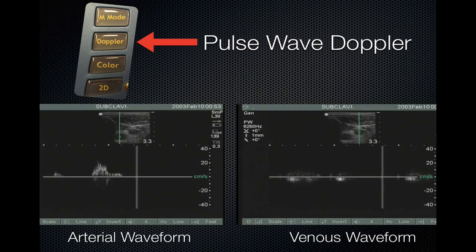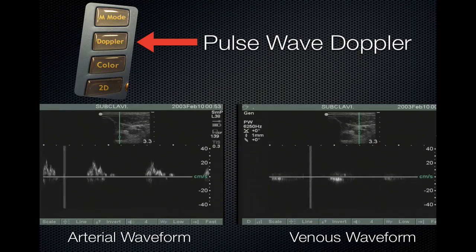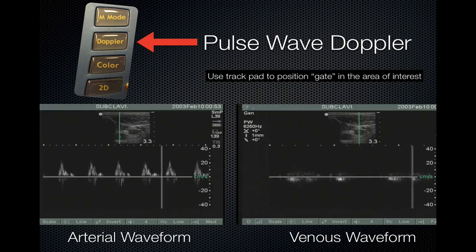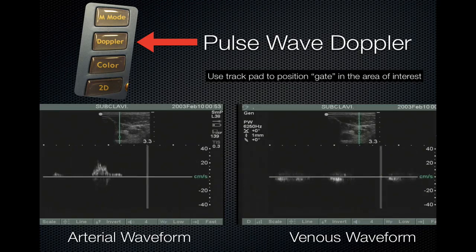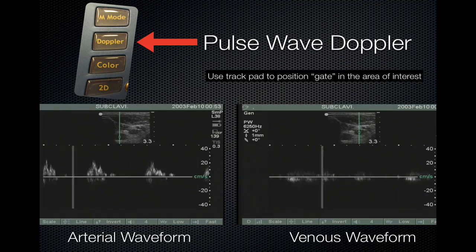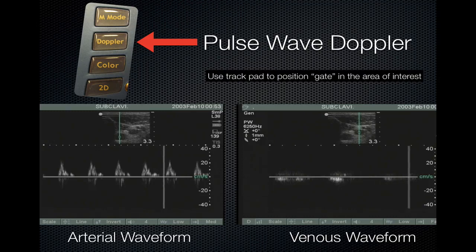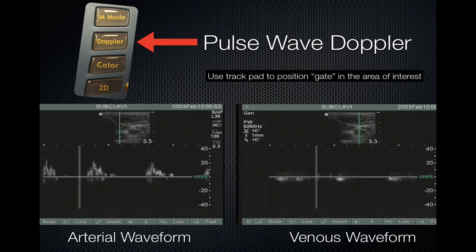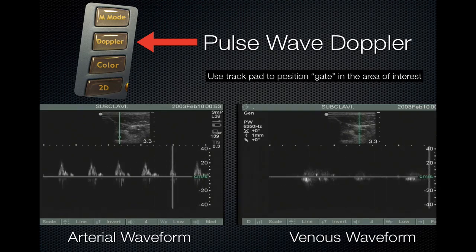Doppler is a measure of velocity. Press the Doppler button, then use your trackpad to position the gate or hatch marks in the area of interest. Press the Doppler button again — this will provide a waveform indicative of velocity. The velocity marks in centimeters per second are located to the right of the screen. Notice that arterial waveforms are pulsatile and venous waveforms are not.